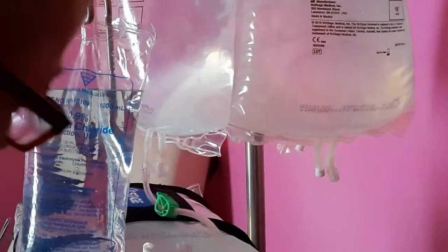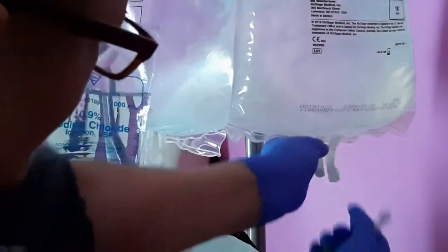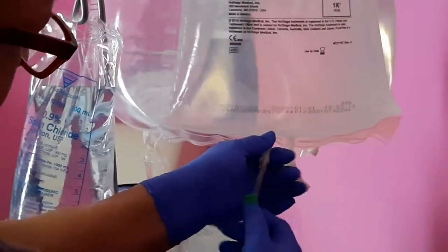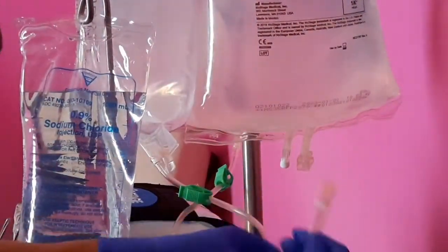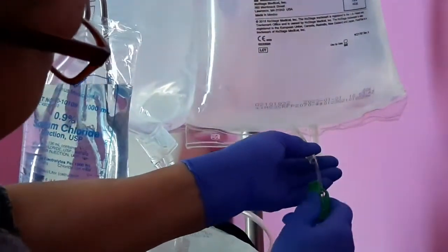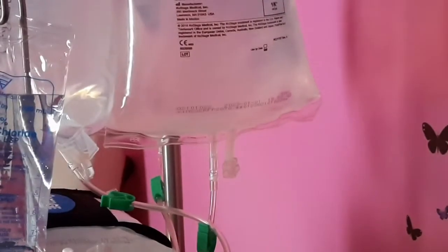Sometimes frangibles will be already broken. And the frangibles are, this is the neck to the tube there, to the little port. Alright, and we're going to do that with all three bags. We're going to attach these lines, these multi-line adapters, and then clamp. And then last but not least, the third one, getting the third line, removing the cap and the white cap, and screwing that on there. Okay, so now we've got our multi-line adapter attached to our dialysate bag.